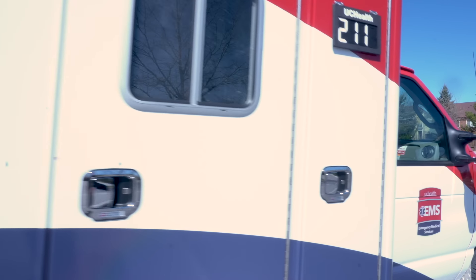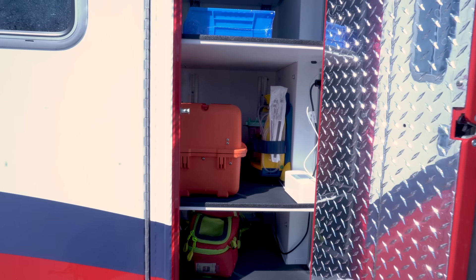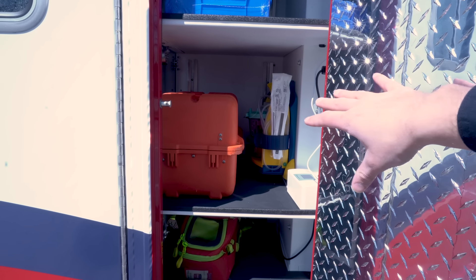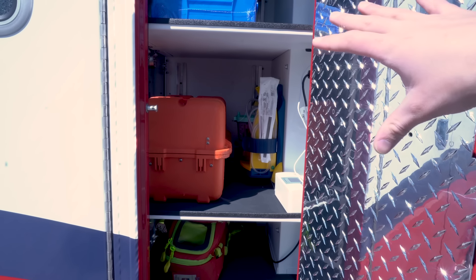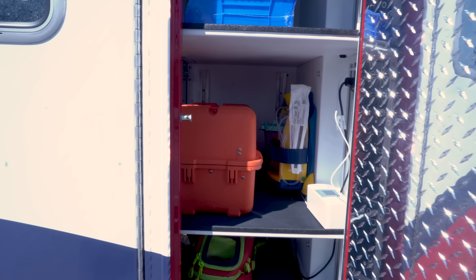Right behind the passenger seat, this is an interior cabinet that can be opened from the outside. We've got our Medbox, O2 bag, and suction that we can grab from the outside of the rig pretty easily. It's a nice cabinet to have — if we're going on a cardiac arrest, we're taking everything including the kitchen sink, open this up, grab what we need, and go in.